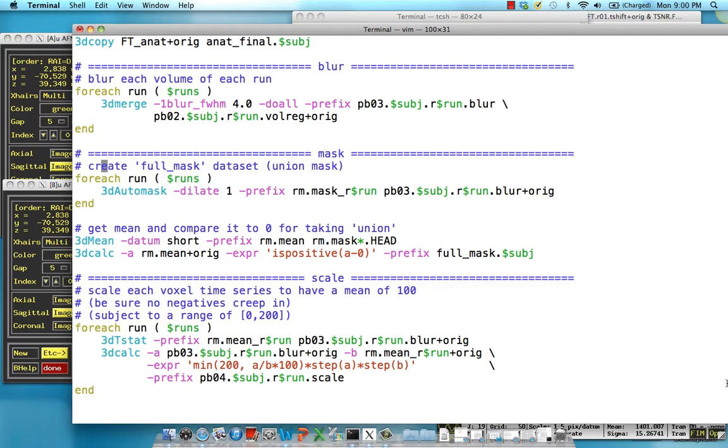And we do that with creating a mask. Now for this single subject analysis, we're not going to actually be applying the mask at any step in the pipeline, but if you wanted to do something like cluster correction thresholds, you could use this mask to determine what an appropriate cluster correction would be.